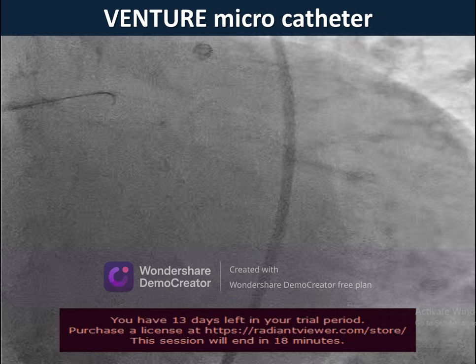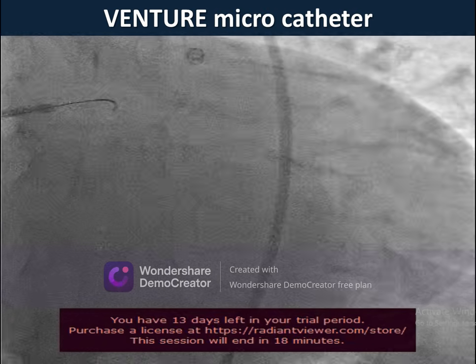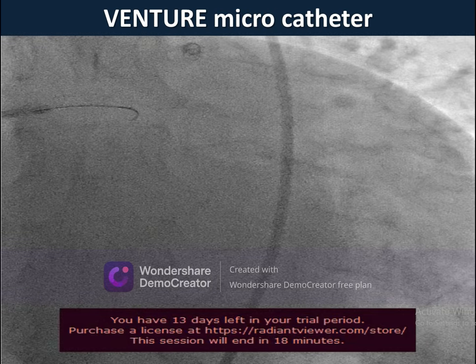So at the failed trial that was done 2 weeks before this intervention, the problem was that any wire trying to hit the proximal cap of the in-stent restenosis of that OM buckles in the LAD, because of the straight, right-angled left main to LAD.